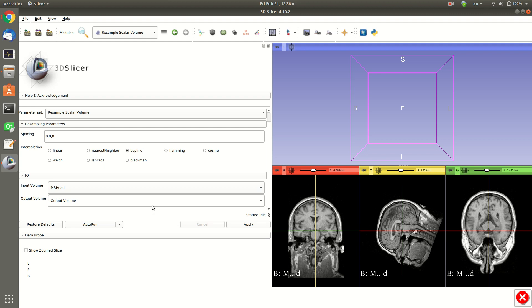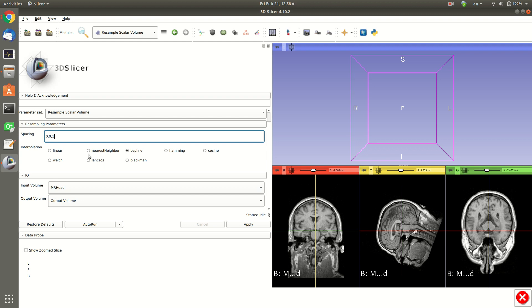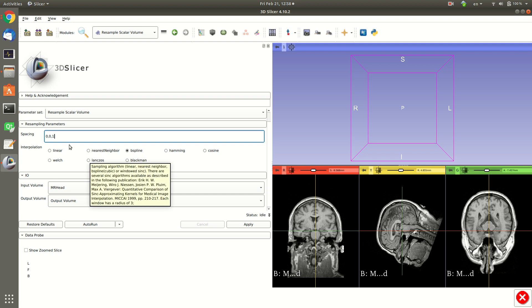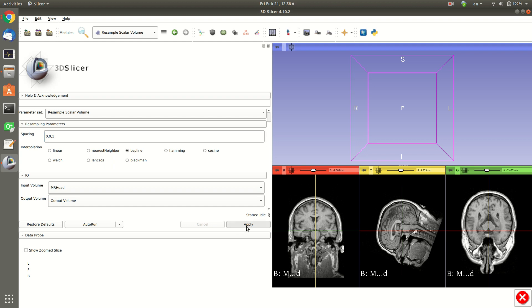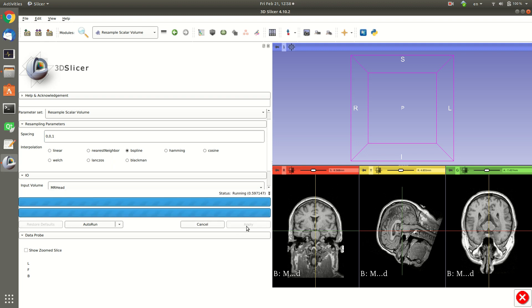So in the last one I'll just select one, so instead of 1.3 we will have one. If you leave it as zero this means it will keep the previous spacing. Now when I click apply we will get a new volume with the new spacing.